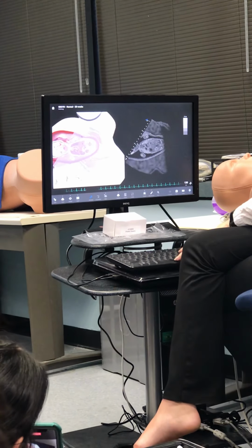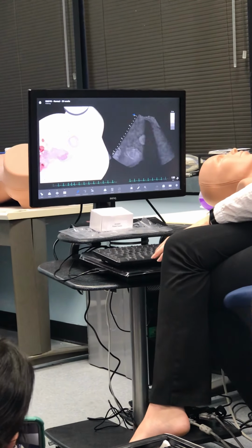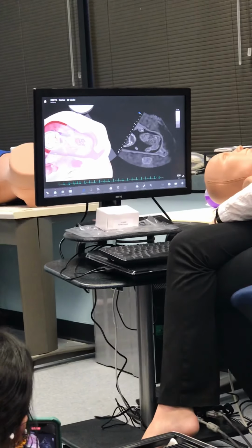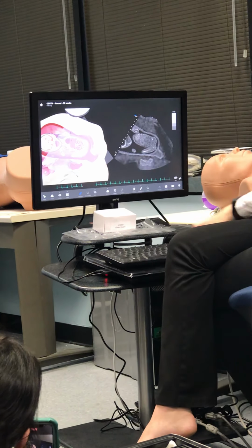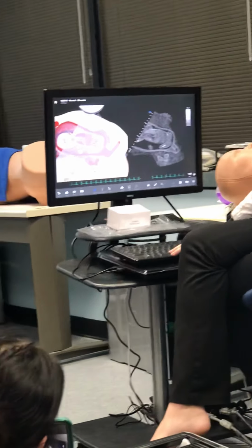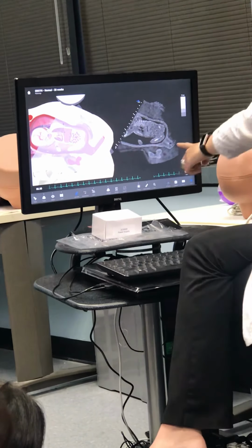As far as the phantom goes, you're wanting your image. Isn't that so nice? They gave her bowel shadow too. How kind. That is disrespectful. Oh, hey, look, she has an ovarian cyst too. Wow, look at that.